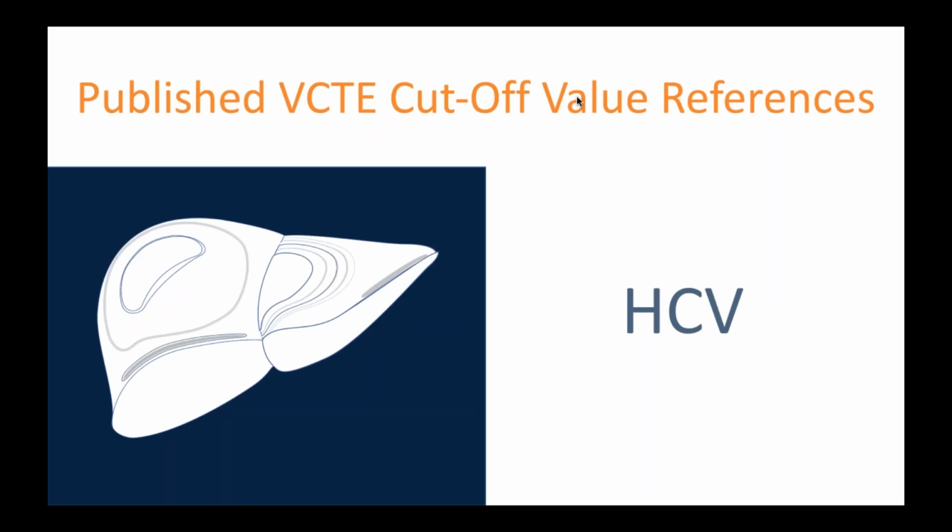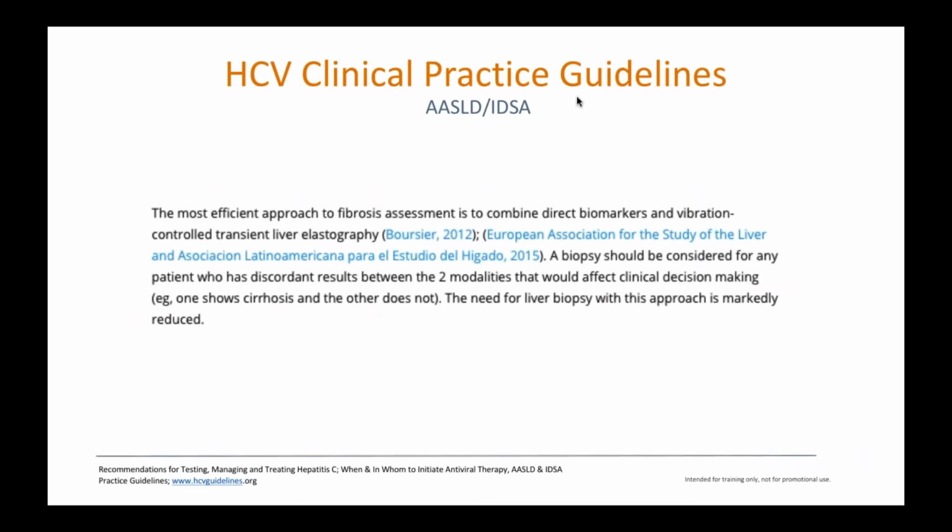Now let's get into what are the more recent published VCTE cutoff values, and I want to start out with the specific disease of hepatitis C. So everything I will be showing you here for the next few slides will specifically relate to HCV guidelines.